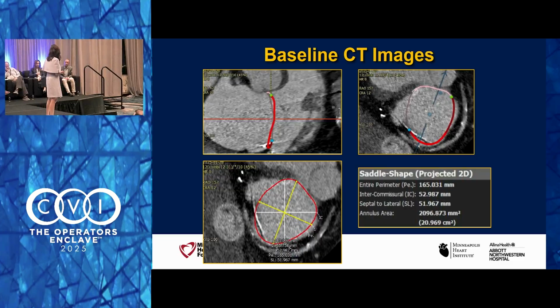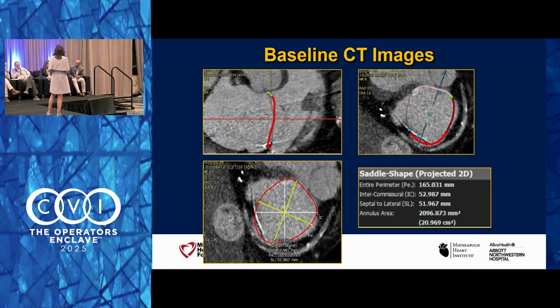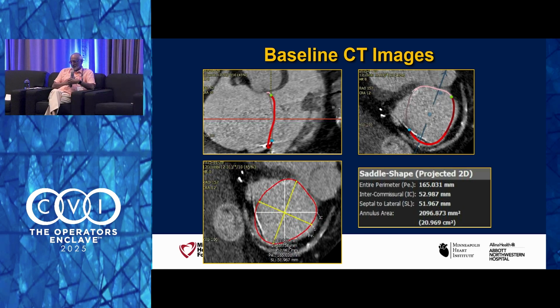What are your thoughts, panel? So Manny, you do a lot of replacements. The challenge here is the perimeter is 165. I don't do them, I just watch them do it. You know he's going to get back to you. Perimeter is 165 here. I mean, it's really up there. Isn't 160 the top? I'm not sure what the cutoff is.